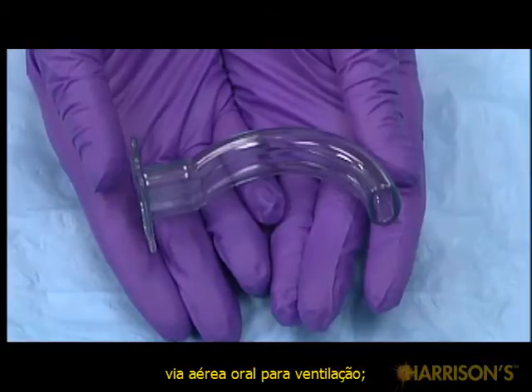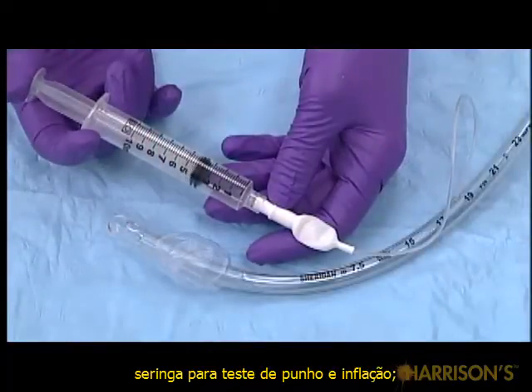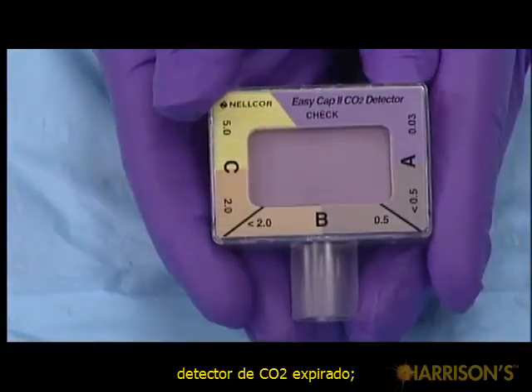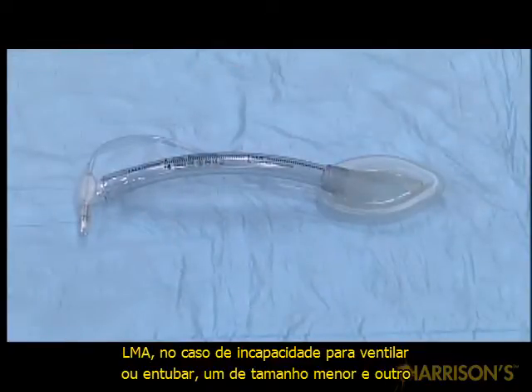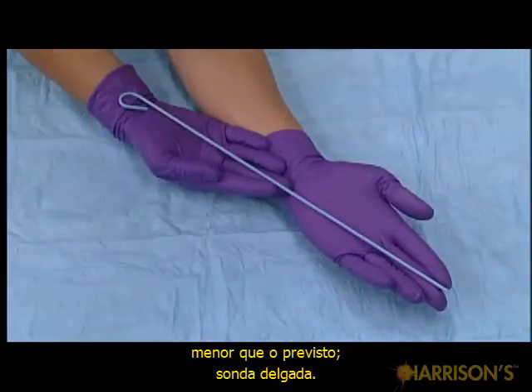airway for ventilation, endotracheal tubes, one size smaller and one size larger than presumed size, syringe for cuff testing and inflation, laryngoscope handles, laryngoscope blades, a curved Macintosh and a straight Miller in various sizes, end-tidal CO2 detector, stethoscope, tie or tape for securing the tube, LMA in case of inability to ventilate or intubate, one size smaller and one size larger than presumed size, stylet.